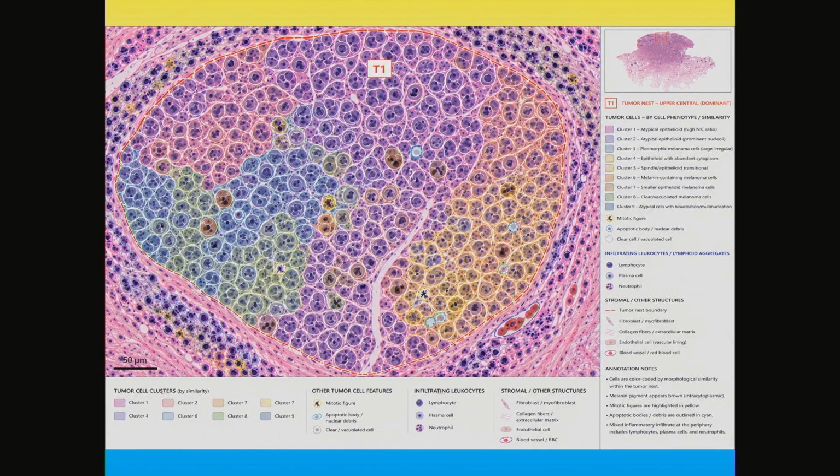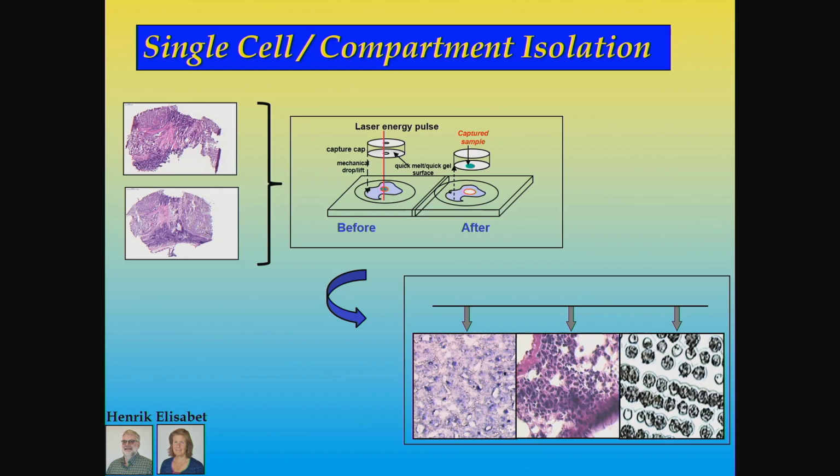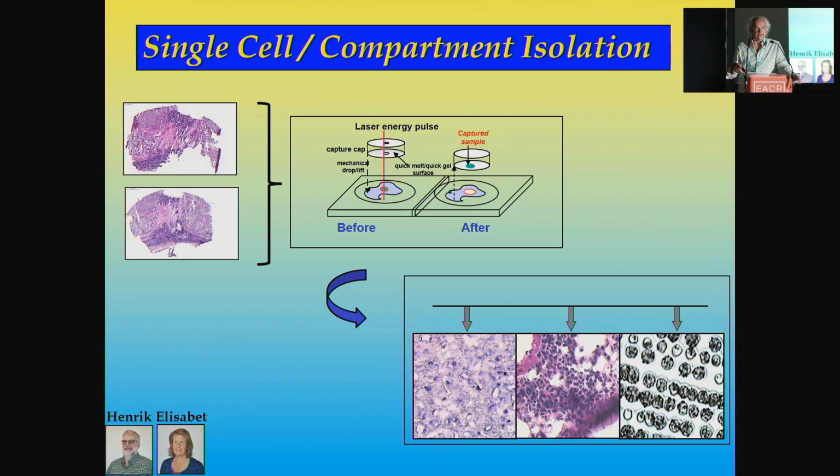In this way, you will have very high numbers. Imagine you get like 600,000 cells identified within one section. And then you move up to 1,000, 10,000, 100,000 sections from multiple thousand patients. Well, you get my point. And from there, we are also attacking in a single cell mode. On the right-hand side, you can see how we isolated single cells within tissue by laser microdissection. The whole idea here is also to have spatial readout and to understand what is really happening in compartments within the tissue.